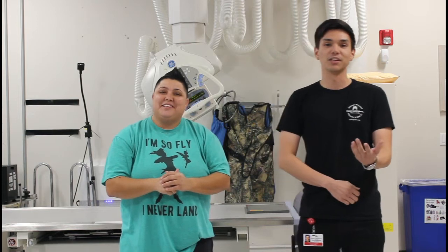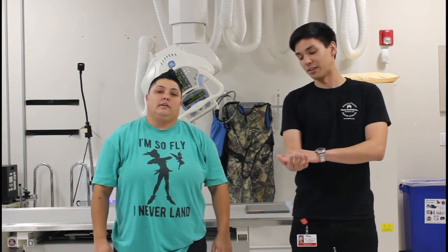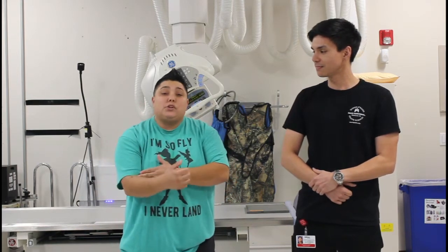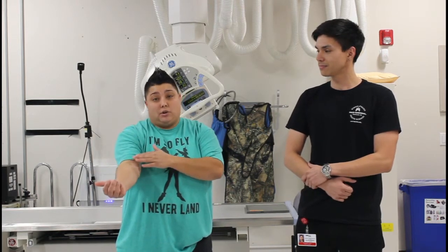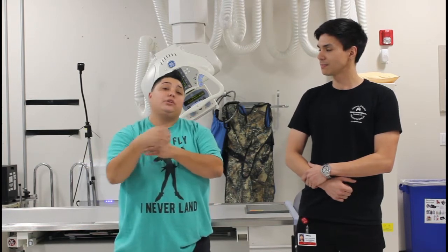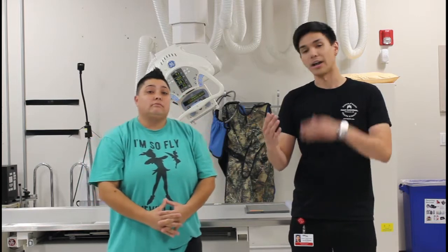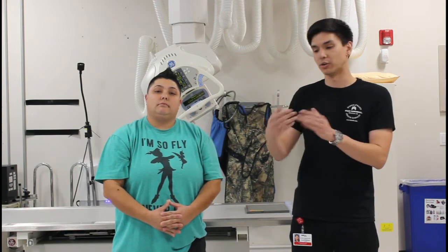And so for any of you that don't know, the Coyle method is an exam to evaluate the radial head of the radius. And so Mel, why do we do the Coyle method? We do the Coyle method because we are concerned with a possible radial head fracture, and the patient usually cannot fully extend their arm for protocols to get the lateral oblique. So we angle the tube to get a better visual of the radial head. Mel, that's absolutely right. So the reason why we are angling the tube is to take advantage of the elongation of that tube angle into the forearm.